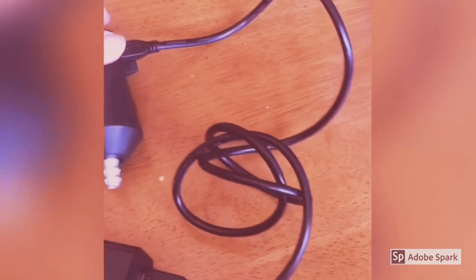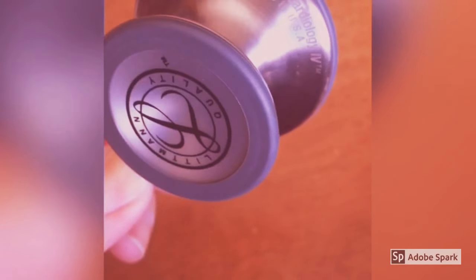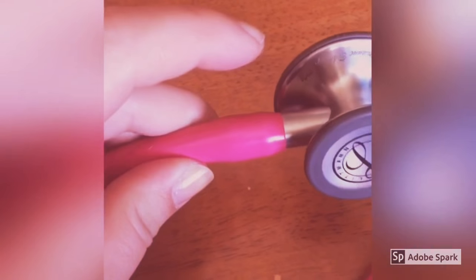You just plug it in — there's a little door that opens and you can just plug this cord in. This is my beautiful pink engraved Littmann Cardiology 4 stethoscope, and this little beauty is the one we're going to be putting the echo on right here.